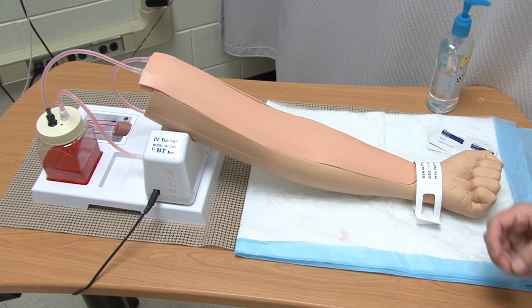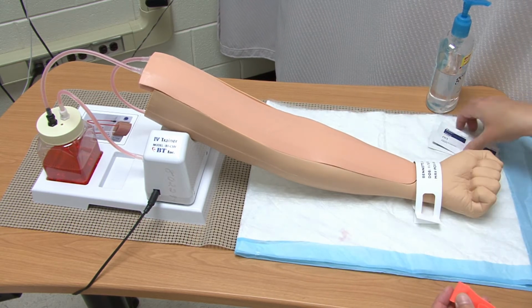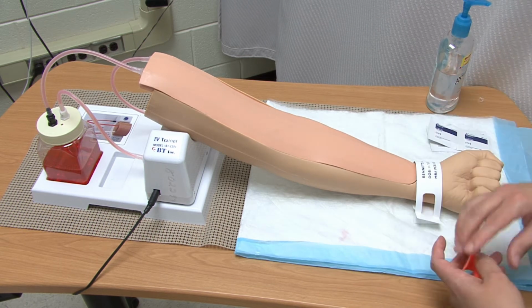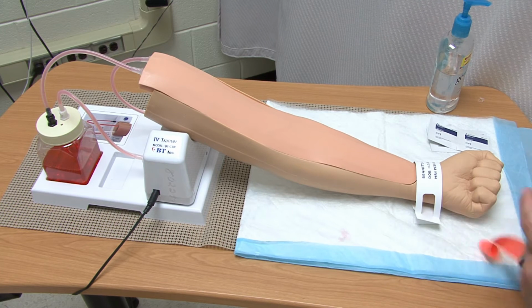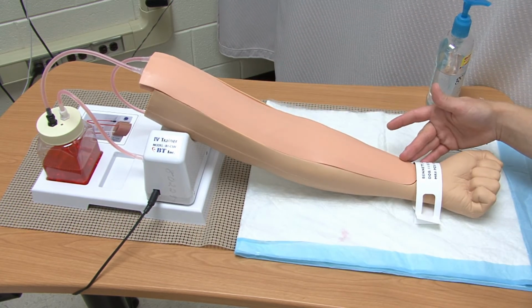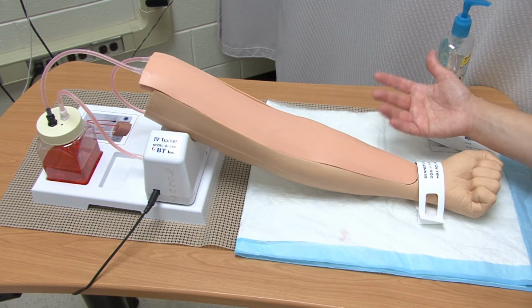Whenever you're going to take a look at your patient's arm, it would always be good to have a tourniquet. Then I usually use alcohol, as long as your patient's certainly not allergic to it, to help the vein be visualized a little bit better. When you're looking for the site, you can pretty much tie it above the AC and look down. But when you go to initiate the IV, you usually want it 3 to 4 inches above the site.